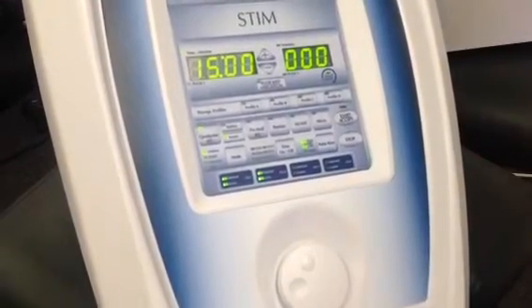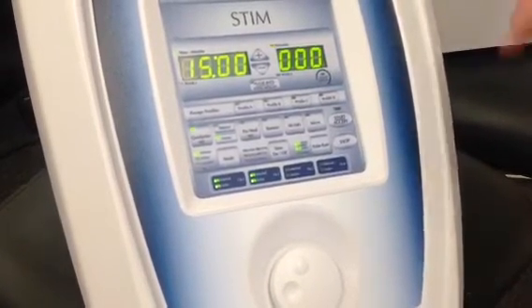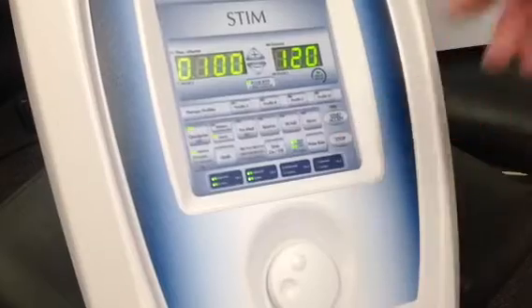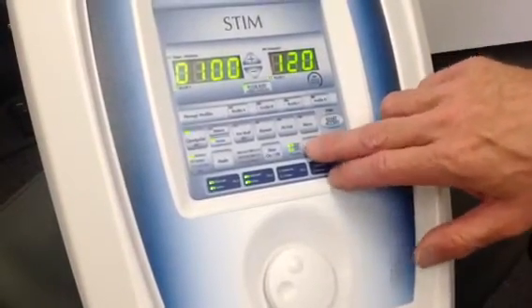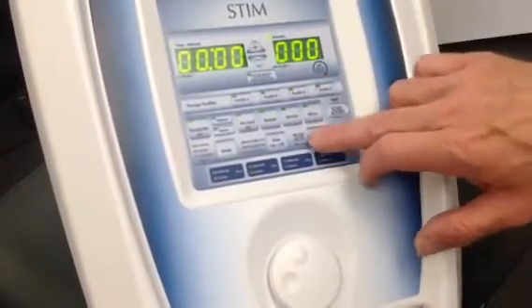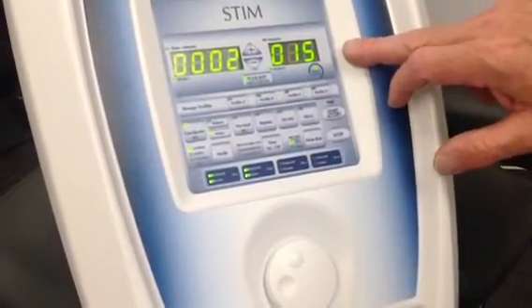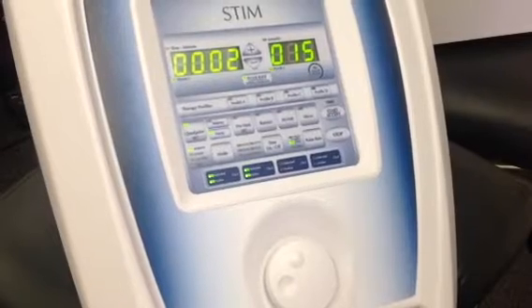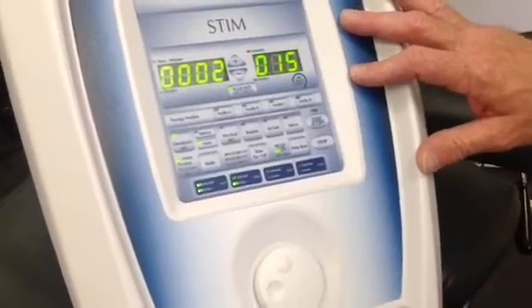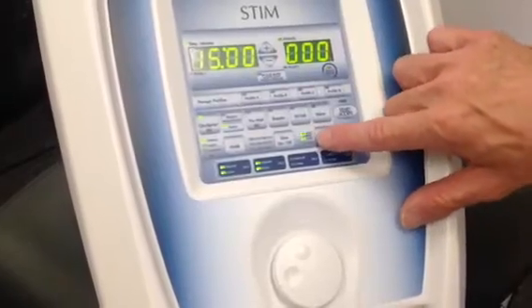High-low is it's going to actually split the 2, so you're going to get 2 completely different sensations from the patient standpoint. Okay, they're going to get 100 to 120, and halfway through they're going to get 2 to 15. Quadrupolar, low. They're going to get 2 to 15. So it's two completely different fields. You may or may not want that. It's actually good for the patient because they're going to get more endorphins and enkephalins at varying rates, but it's a very different feel to the patient as they go through it.